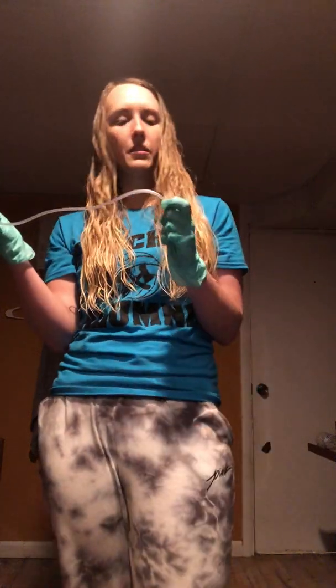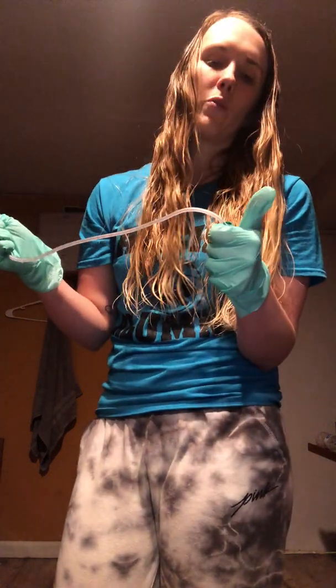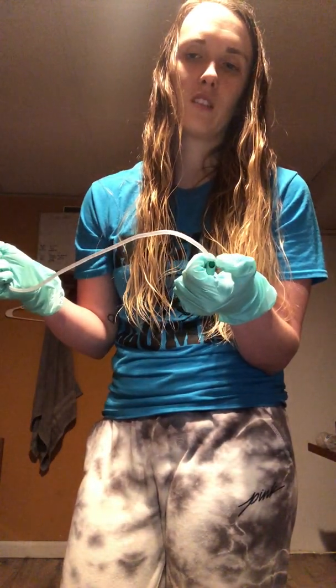Once I have that all set up and ready to go, I'm going to get my suction catheter out of the kit, and I'm going to grab towards the end of this with my sterile hand. That way we keep everything sterile at the end of this. And then grab the other end with my non-sterile hand. So this is the end that I'm going to suction with, and then the one that I'm going to apply the suction with. You're going to apply your finger over this hole, and that's going to cause this to suction.